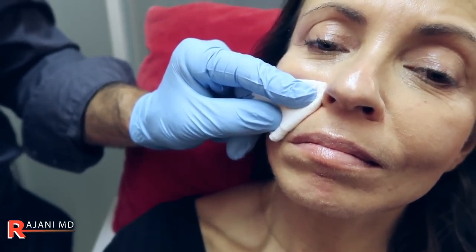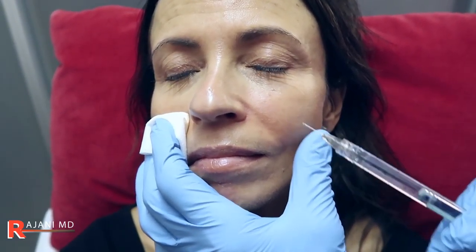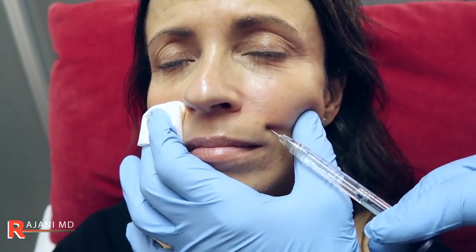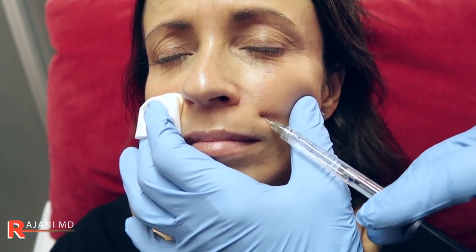Now we'll move to the other side. I'm going to show you a droplet technique over there. Coming to the other side, we're going to cleanse. I'm holding pressure over here because that's where I injected, and that will help prevent a bruise. The droplet technique I often use in the lower face, which we will demonstrate, but here I'm going to come in inferior. You're not deep here — injecting at 0.05 and walking up towards the fold.